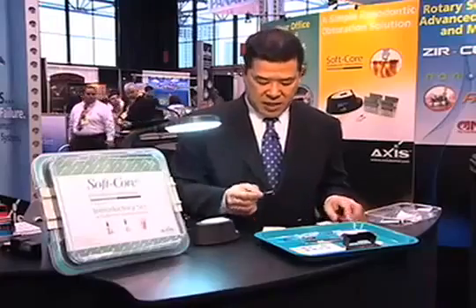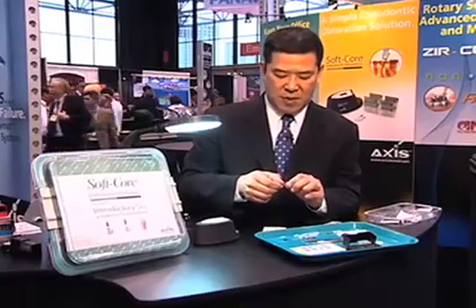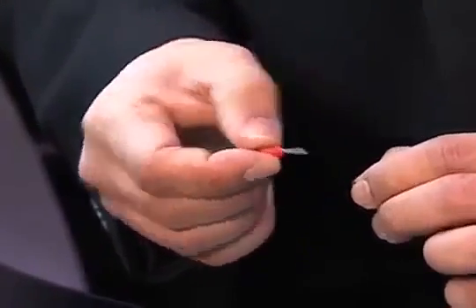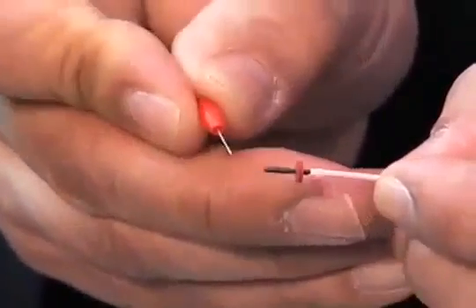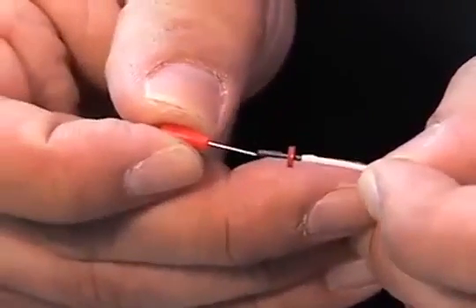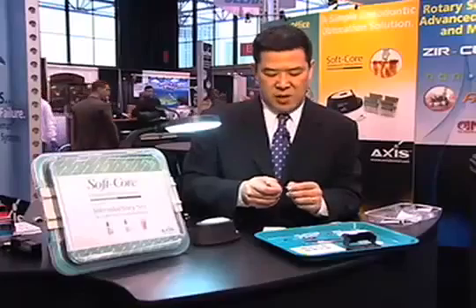With that in mind, I'm going to take the obturator and make sure that the pin at the top, the metal pin which comes out, is loose. I'll demonstrate here by actually removing it from the obturator. Now the obturator itself, the gutta percha is 18 millimeters. The plastic piece is 24 millimeters. And the pin of 6 millimeters allows you to extend it probably to about 31, 32 millimeters for the longer canals. Here I want to make sure it's loose because later on when I go to remove the pin, I don't want the whole piece to come out of the canal as it's still warm.